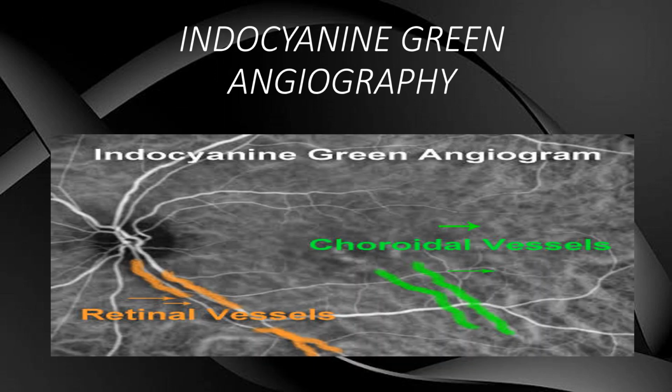Just like fluorescein angiography, there is indocyanine green angiography. It is mainly used to evaluate abnormalities in the choroidal vasculature, conditions often seen in macular degeneration. This dye will be injected intravenously and multiple images will be captured using digital video angiography over a period of 30 seconds to 20 minutes. The dye is generally well tolerated, but some patients experience nausea and vomiting. Allergic reactions are rare. However, indocyanine green angiography is contraindicated in patients with a history of iodide reactions.